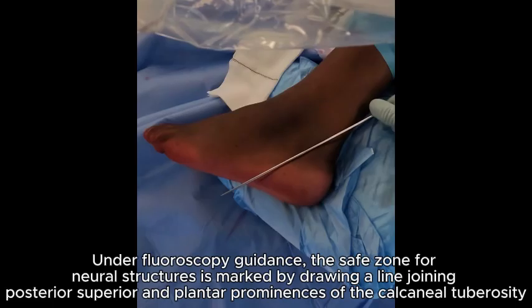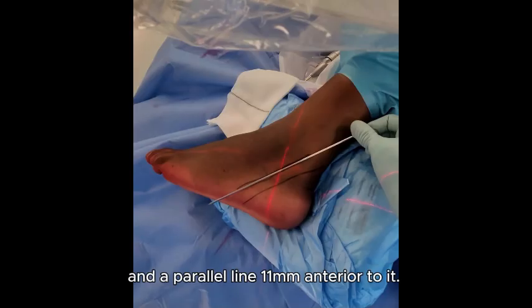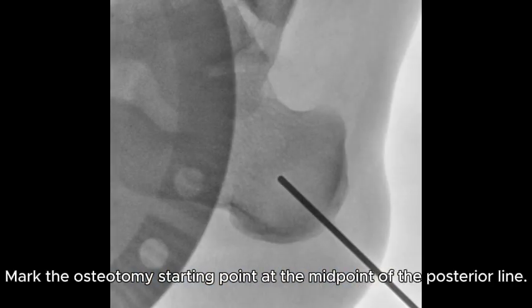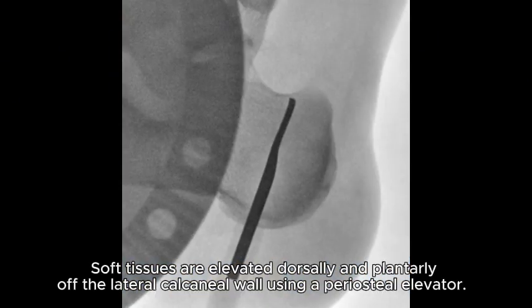The safe zone for neural structures is marked by drawing a line joining posterior, superior, and plantar prominences of the calcaneal tuberosity and a parallel line 11 mm anterior to it. Mark the osteotomy starting point at the midpoint of the posterior line. Soft tissues are elevated dorsally and plantarly off the lateral calcaneal wall using a periosteal elevator.